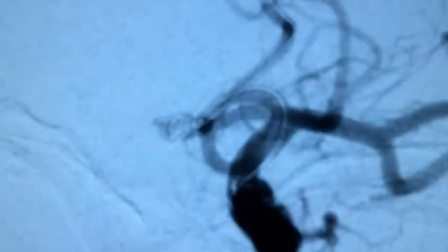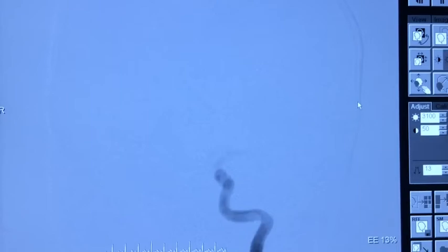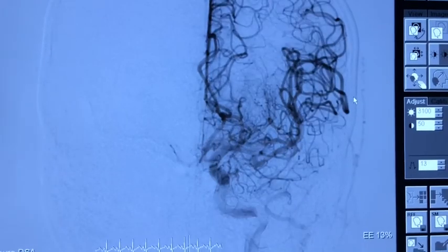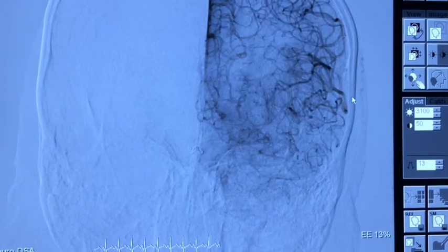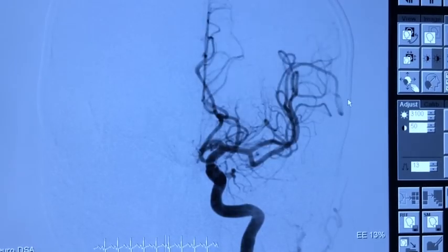We can see the angiogram after multiple coils have been placed with balloon assistance into the anterior communicating artery aneurysm. The aneurysm is now completely occluded with coils, the parent arteries are patent, and the aneurysm is fully excluded from the circulation.